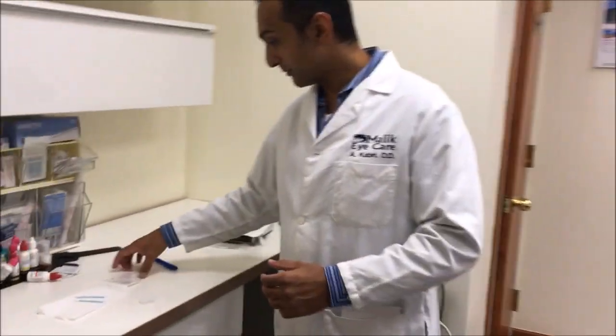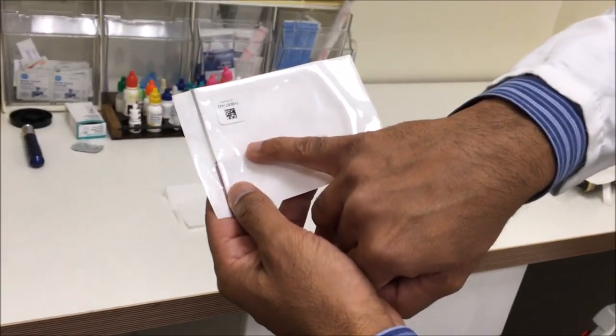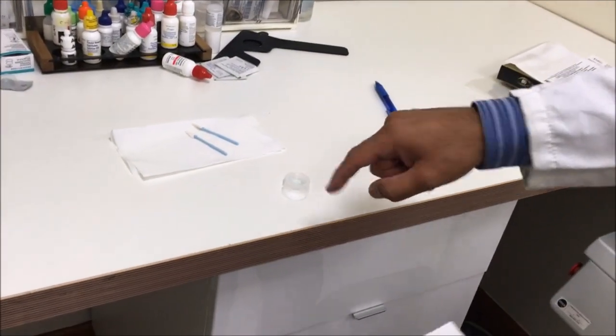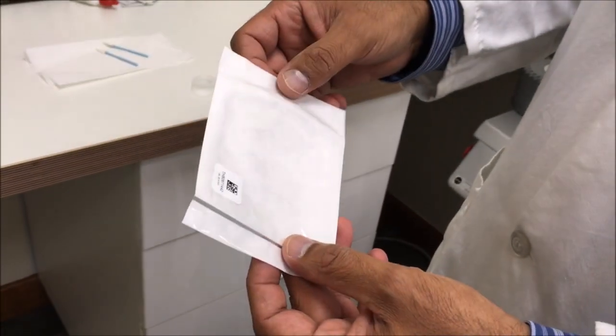Come on close, I can show you what we have. Right about where my finger is pointing you can see our dry amniotic membrane here. We have a Wex cell sponge. We also have a soft contact lens which will serve in a role as a bandage to kind of keep everything in place for the next few days while the amniotic membrane is degrading on the surface of the eye.